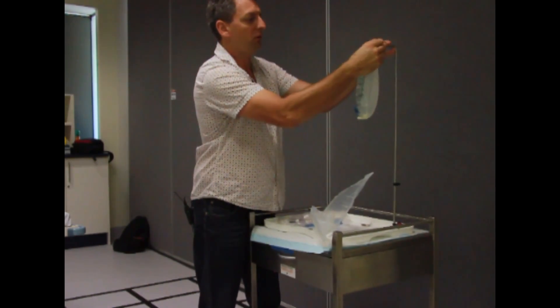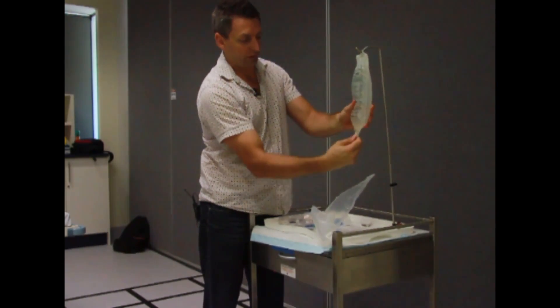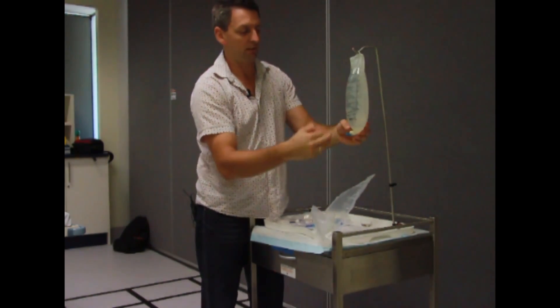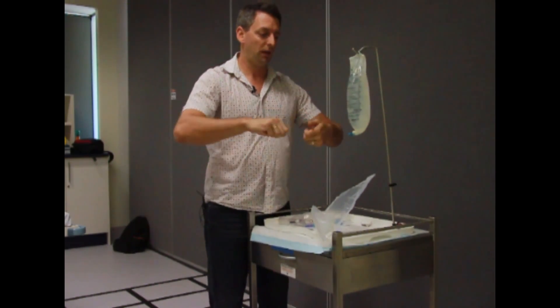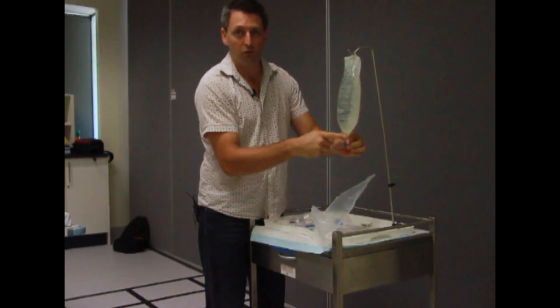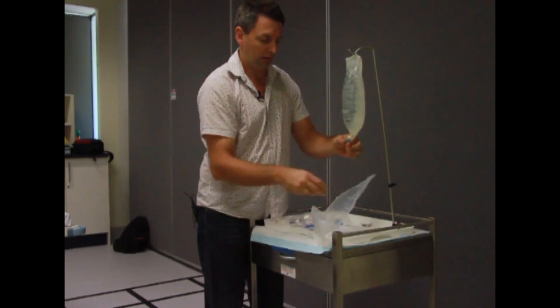I always hang the bag first, pull down the little port, and then twist off the blue cap — so that's ready to go. The reason I hang it: I don't like having it in my hand because if you go to spike the bag, there's a good chance you can go through the side and you're letting all the fluid out and infection in.